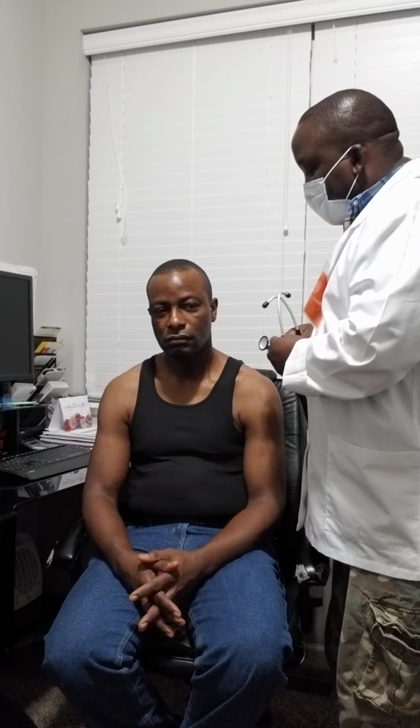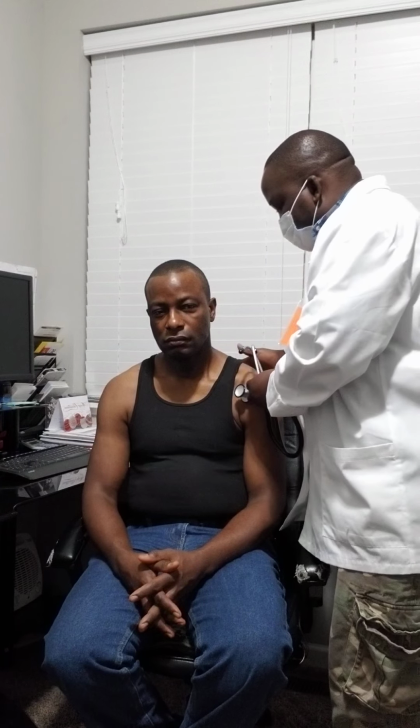Next, you go back again. You're going to sit back. Next, again, you go back and follow the same process. You listen to the second right intercostal space where you find the aortic valve, and you listen now using the bell of the stethoscope. The reason why you're using the bell of the stethoscope is you want to hear those low-pitched sounds that you cannot hear using the diaphragm of the stethoscope.